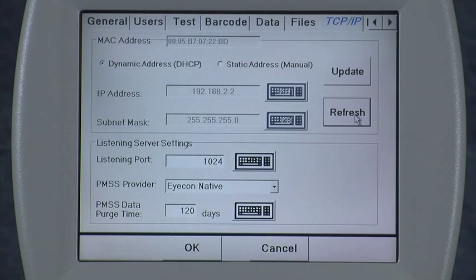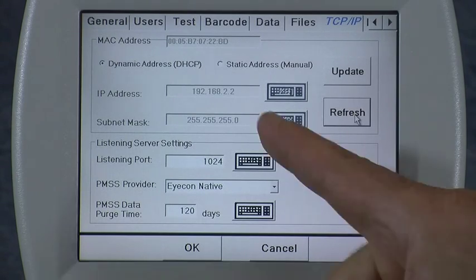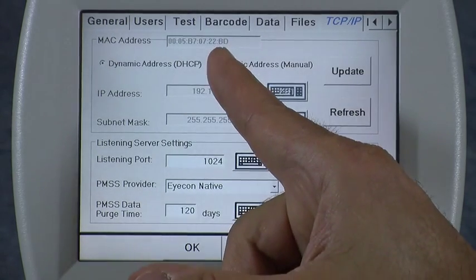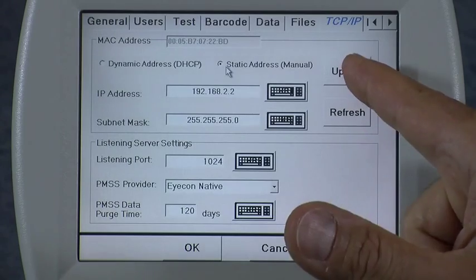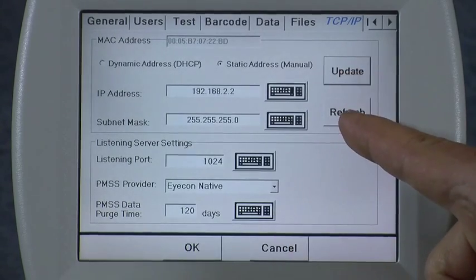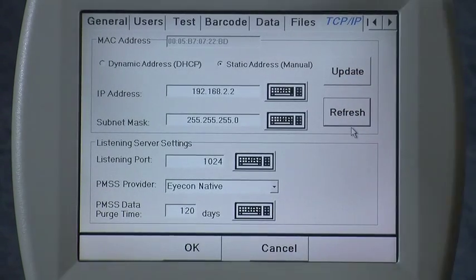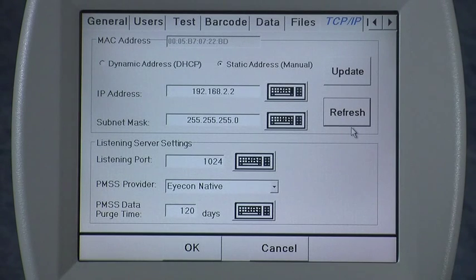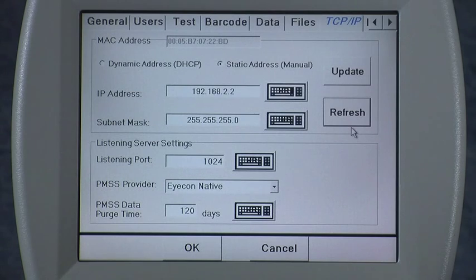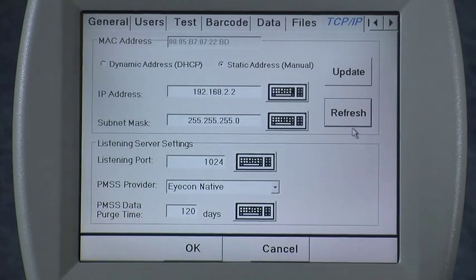Once you've allowed the router to assign an IP address, the best thing to do is change it to a static address and then hit Update and Refresh. This will cause the icon to not get a different IP address every time it powers up, so that your other computers can access the icon at a constant, unchanging IP address.